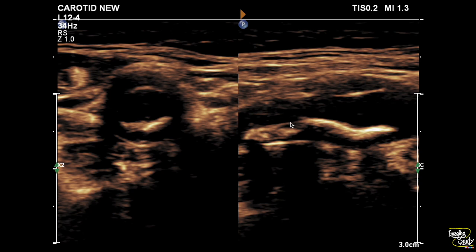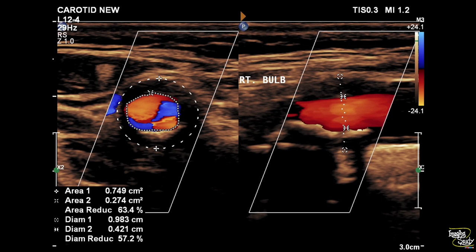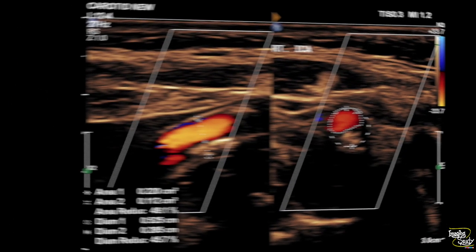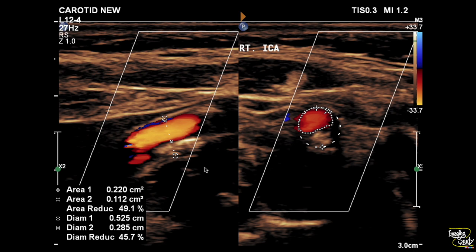Here's the longitudinal and transverse section of the carotid bulb along with the proximal internal carotid artery showing the echogenic calcified plaque. This calcified plaque is causing around 63% surface area reduction, indicating moderate luminal stenosis. The proximal right internal carotid artery is showing the upper limit of mild stenosis.